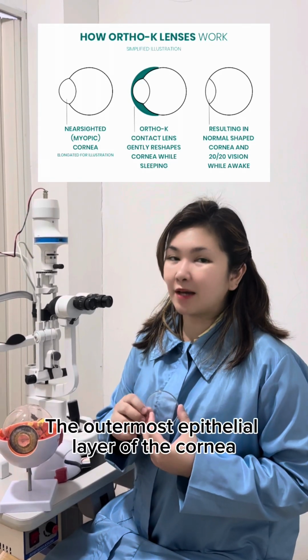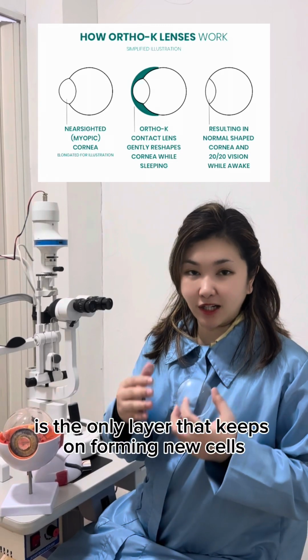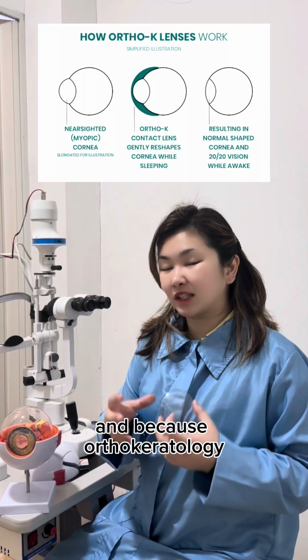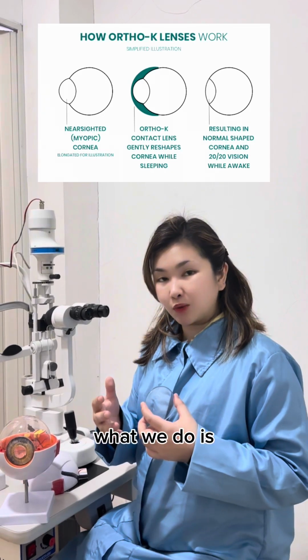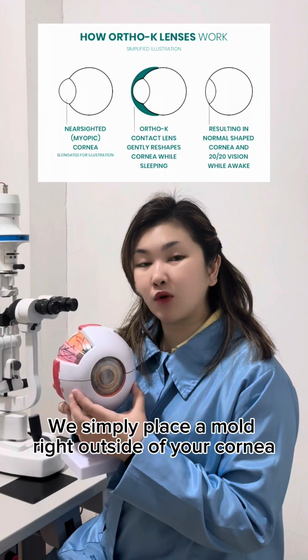Now let's go to the non-surgical method of reshaping your cornea. The outermost epithelial layer of the cornea is the only layer that keeps on forming new cells. And because orthokeratology is a non-surgical method of reshaping the cornea, what we do is we simply place a mold right outside of your cornea.